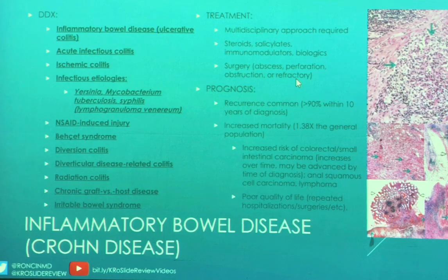Because these patients are prone to fistulas, it is segmental, so you can't exactly remove a patient's entire GI tract, and they'll still have extra GI manifestations in a good portion of patients. So they try to manage what they can medically. Here, this is showing like a poorly formed granuloma.